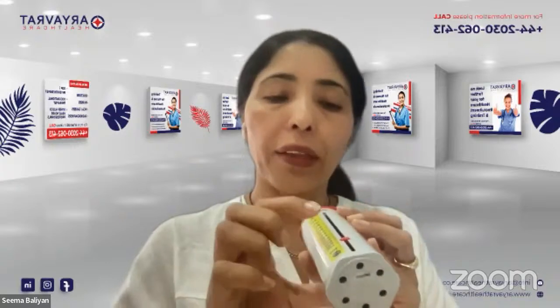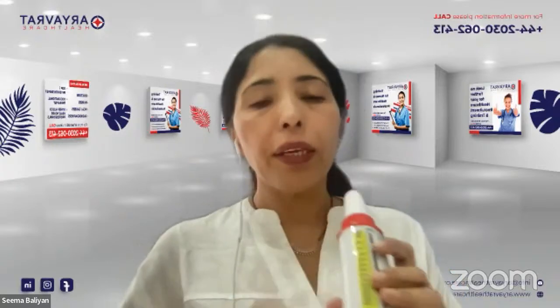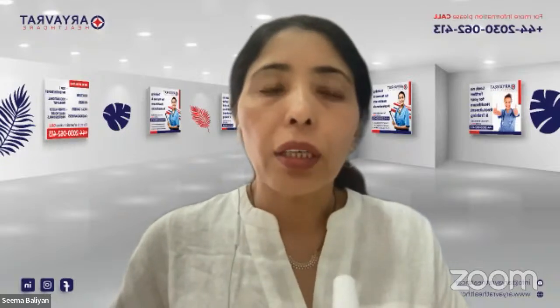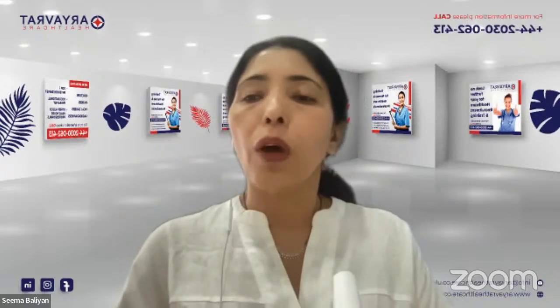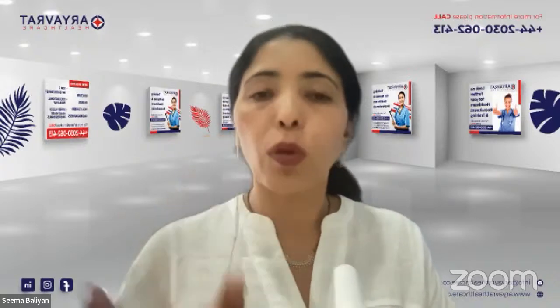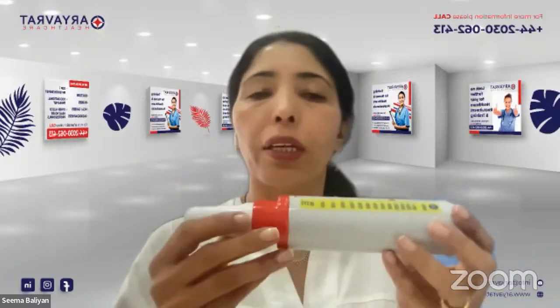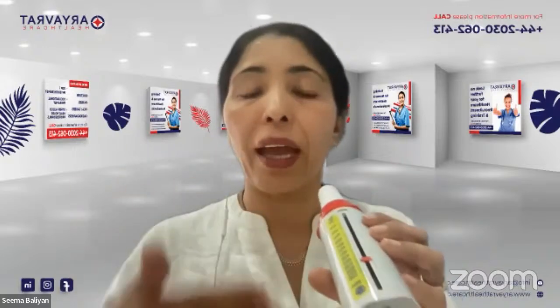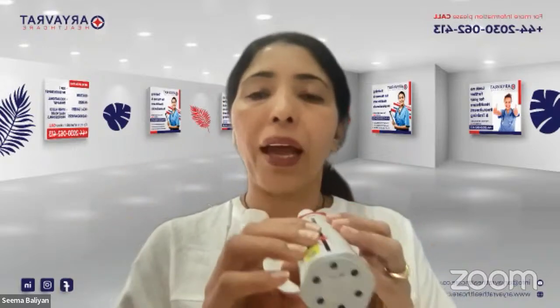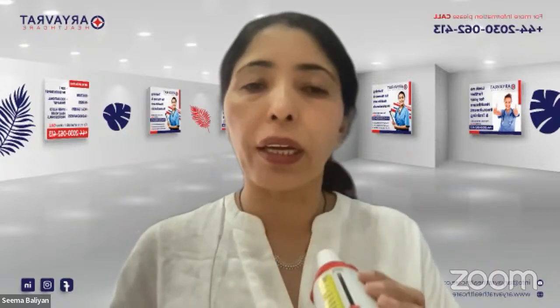So once you have done that, you will note your first reading. In the exam, because all of the skills are done on mannequins, the mannequin is obviously not going to blow out from the mouthpiece, or be able to give you a sharp huff. You are only going to be pretending and saying the same thing. But as soon as you have done this, the examiner is going to give you your first reading.